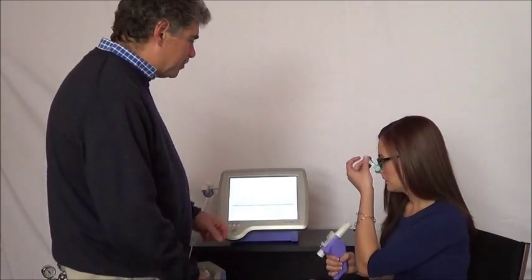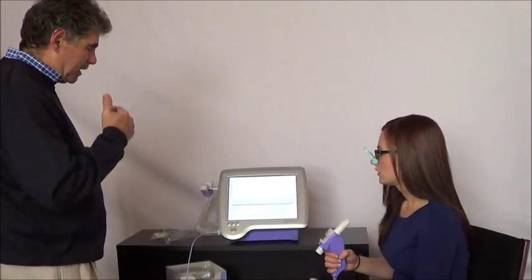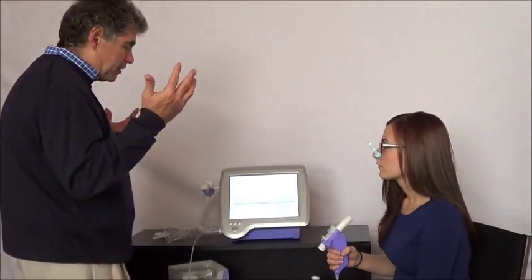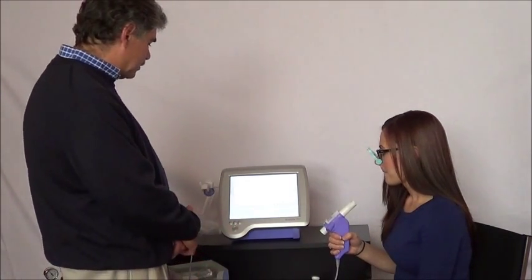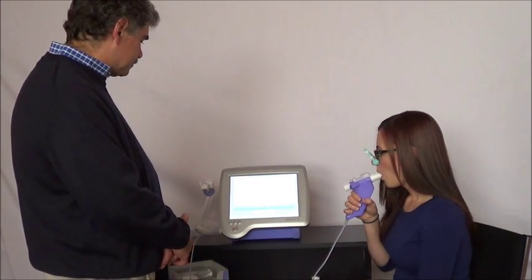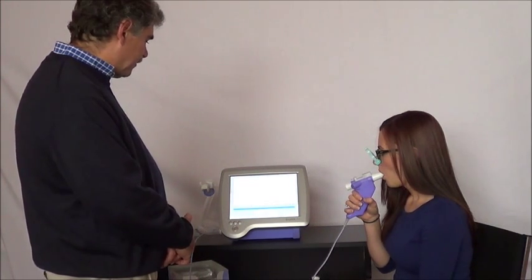I might like your tidal breathing to be just a little more consistent. When you start breathing, try to focus on just breathing as naturally and normally as possible. Then after a moment I'll ask you to start filling your lungs completely and then exhaling completely. I'm going to choose that trial — let's try to get one more good slow vital capacity. So whenever you're ready, breathe normally.